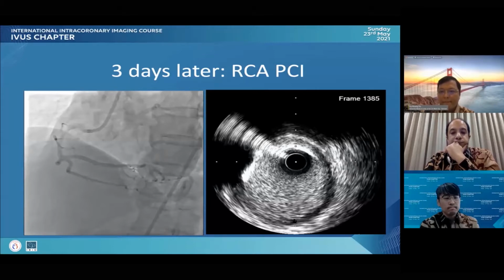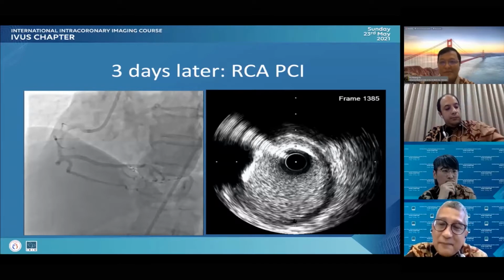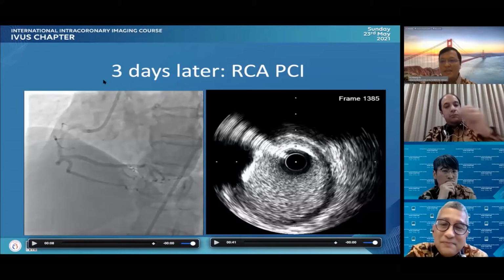Okay, great comment. This is also my question, because it looked like the MLA is not so tight, but we want to intervene in this kind of lesion, right? So I don't know whether it's very popular or not. So Juan, do you do physiology in this kind of situation? So Juan, in Singapore?